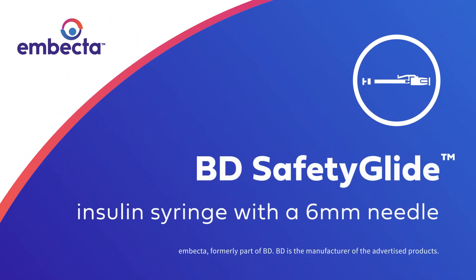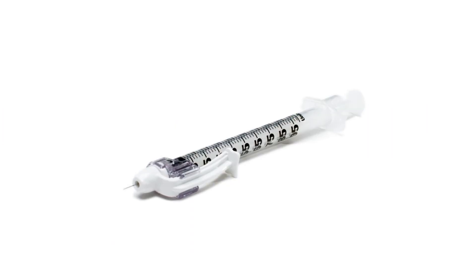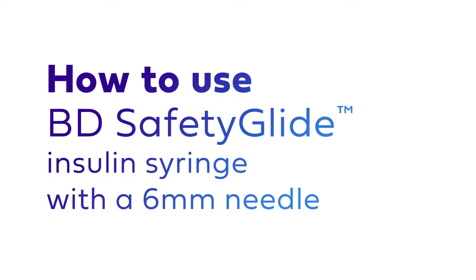The BD Safety Glide Insulin Syringe with a 6mm needle features a one-handed safety mechanism to help protect healthcare professionals and caregivers from accidental needle stick injuries. Let's review how to properly use the BD Safety Glide Insulin Syringe with a 6mm needle.